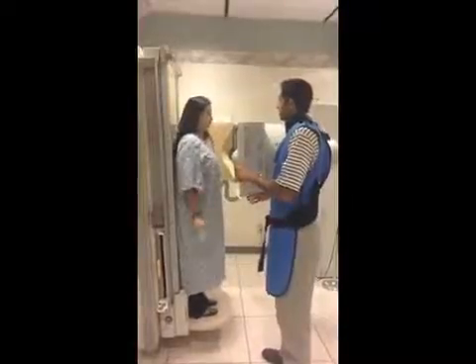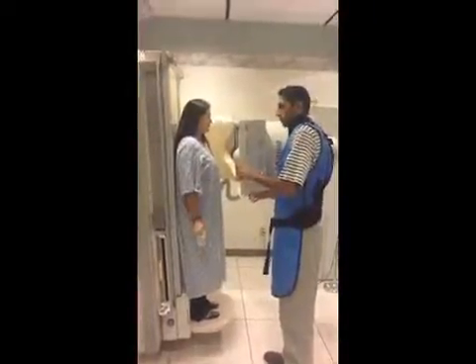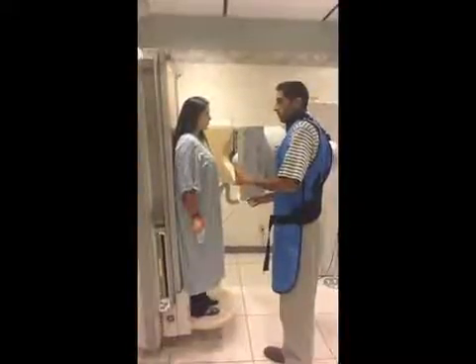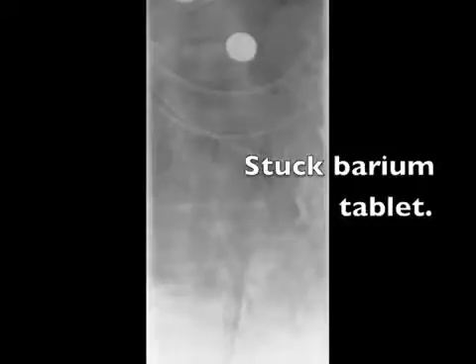After they have swallowed the tablet, fluoroscopy over the esophagus and GE junction to confirm passage of the tablet into the stomach. No image capturing is required. If the tablet is not passed into the stomach, have them take multiple dry swallows or sips of water to assist with its passage into the stomach. This is what a barium tablet looks like under fluoroscopy and when stuck at the gastroesophageal junction.